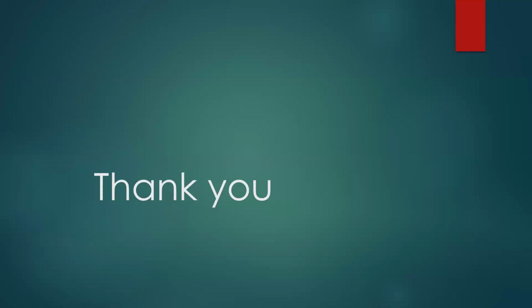عشان كده انا دايره اقول لها هنا الاكسجينال باوبسي is not الطريقه اللي بيتعاملوا بها مع الفيلويدز، لانه they need to know before surgery is it just a fibroadenoma or phylloides عشان هل يعملوا just excision of the lump or to do wide local excision.